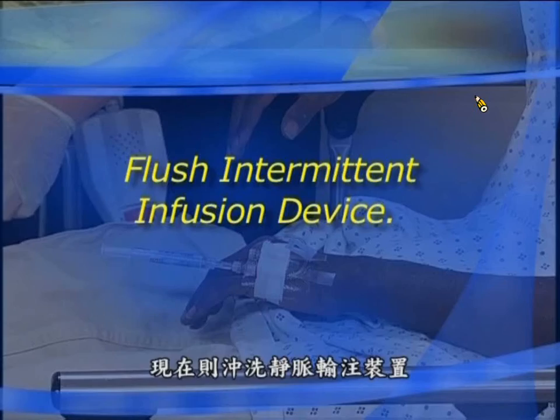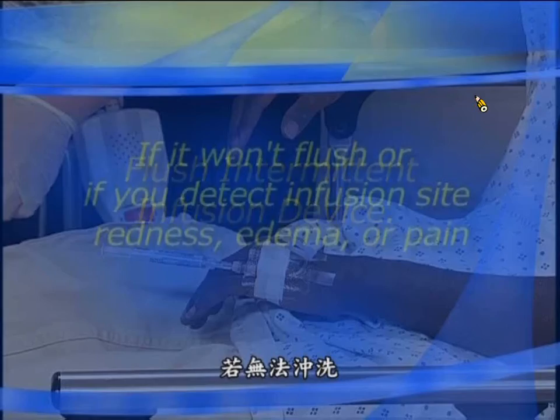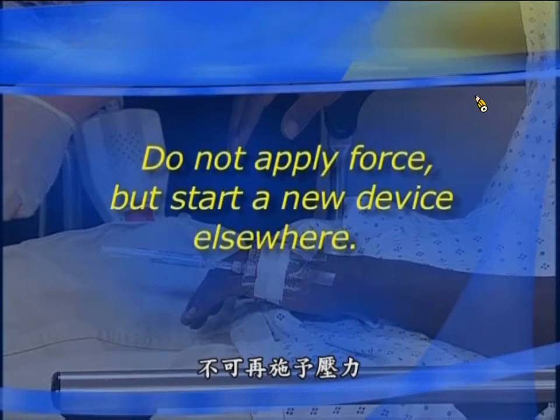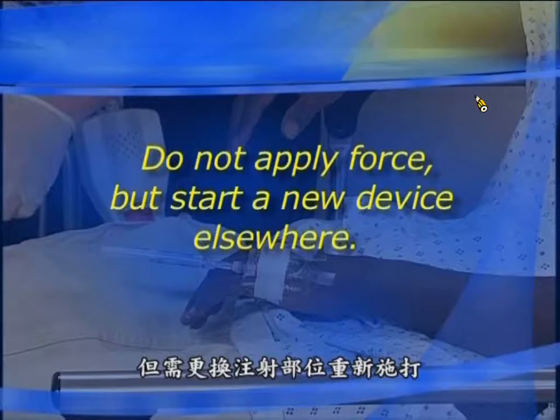Did that hurt? Now flush the intermittent infusion device. If it won't flush, or if you detect infusion site redness, edema, or pain, do not apply force, but start a new device elsewhere.